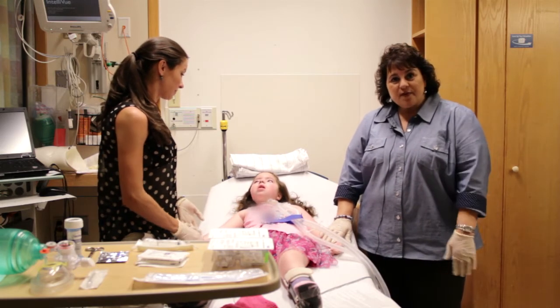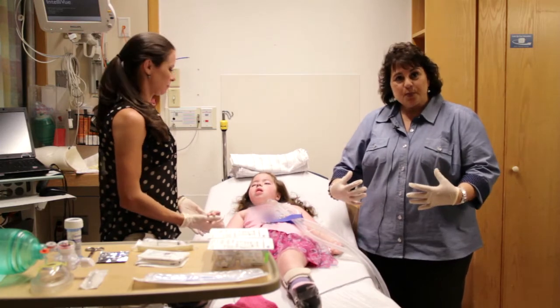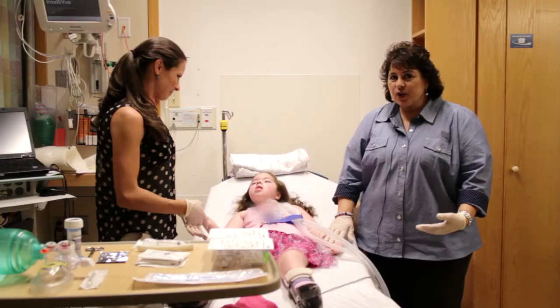We do have a stethoscope available. Some families do use the stethoscope to assure tube placement after it's inserted. Others do not. Like we spoke about earlier, you really want to look at Drew's face and see, does she look comfortable? Do her lips look pink? Is she looking any distress? Is her chest going up and down? Look at her, not at the equipment.